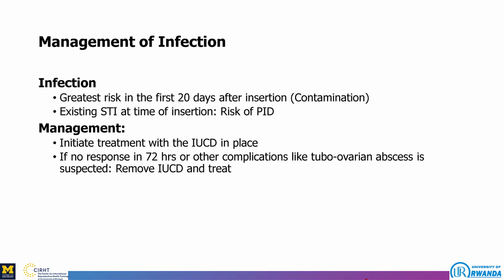Again, if the complication, maybe for example the patient experiences infection, the greatest risk is in the first 20 days after insertion. The woman has the chance to have infection within the first 20 days after insertion. But remember, I told you earlier that the infection is not due to the intrauterine contraceptive device itself, but due to contamination of the device.